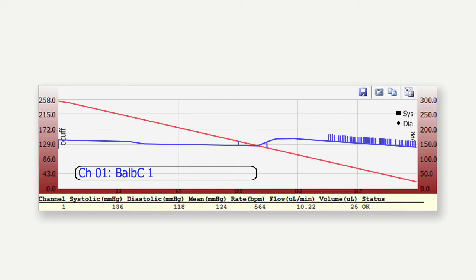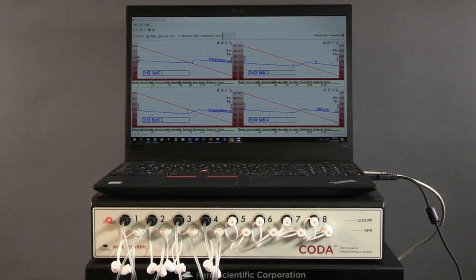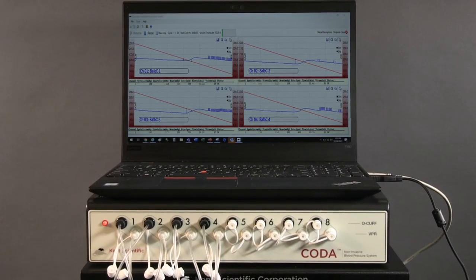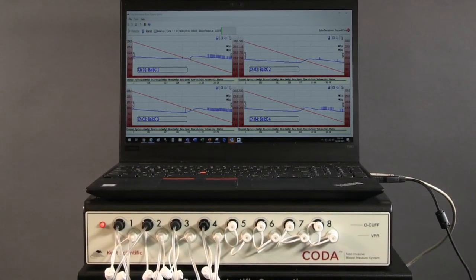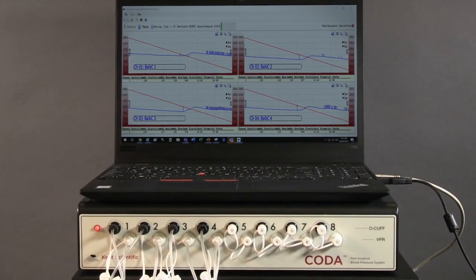At the end of the session, the CODA software will offer options for data management. You may save a simple report for manual data analysis or a full report for software calculated data analysis. The CODA software will also retain each of the graphs for every reading for later review.